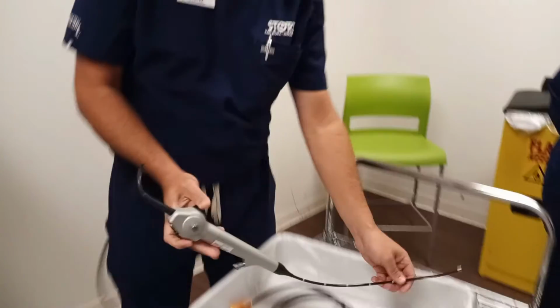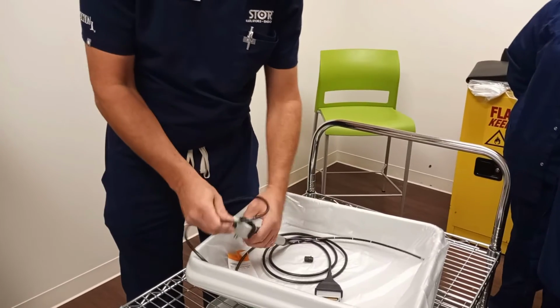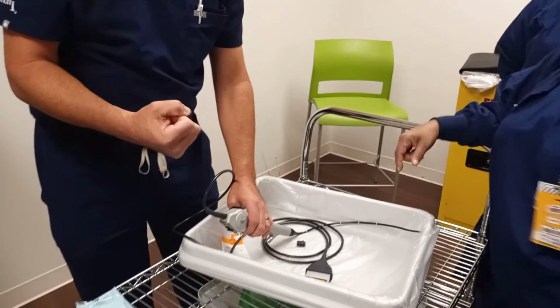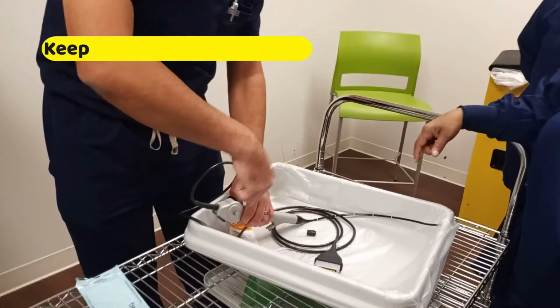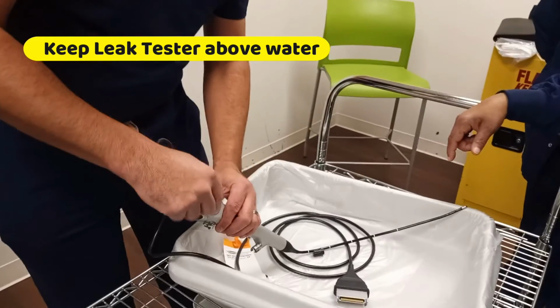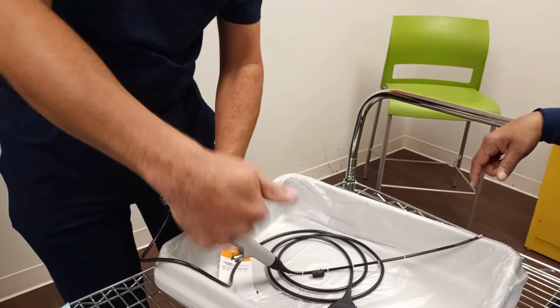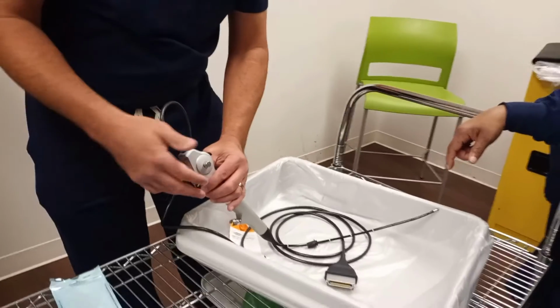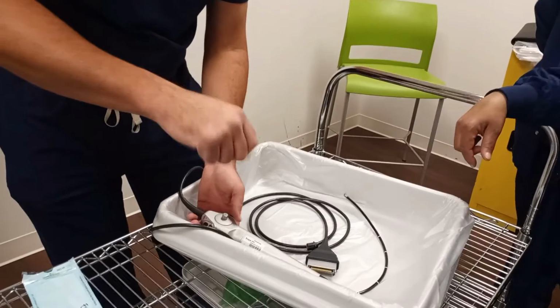We're going to drop the scope into the, let's just pretend this is a sink of water. We're going to drop it into the water. But with the leak tester, you don't want to drop the leak tester in the water, right? Because if you do, water is going to get into that little port right there. The leak tester, when it's attached, opens the port. Water will flow up and get inside the channel of the scope, and it's going to cause fluid invasion. So just make sure that the leak tester is outside of the water.